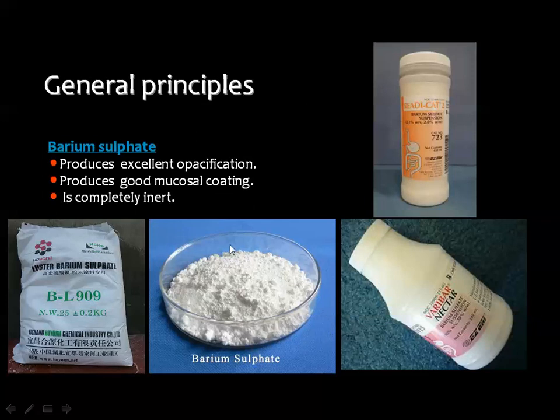Barium, which is used in the diagnostic techniques, is barium sulfate, which is one of the best contrast media for evaluation of the gastrointestinal tract because it produces excellent opacification and good mucosal coating.